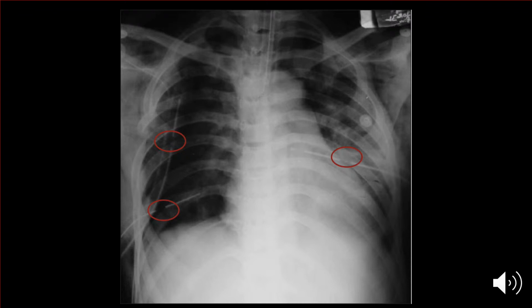No. We call that the most proximal hole. So proximal on the tube to that, there are no other holes. So you have the hole there and then holes all the way to the tip of it.